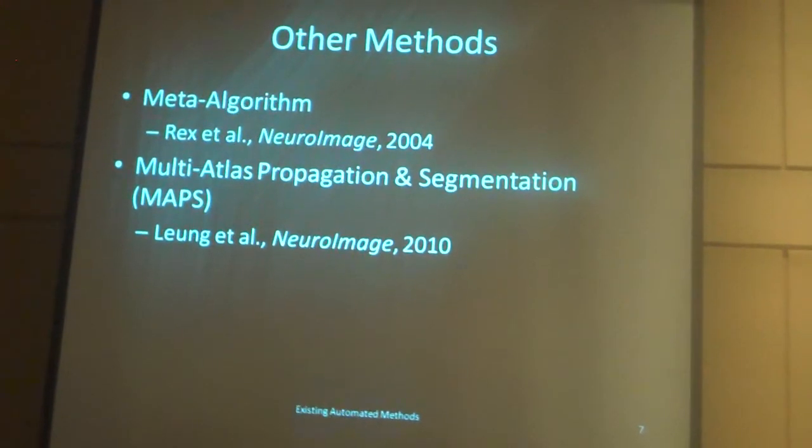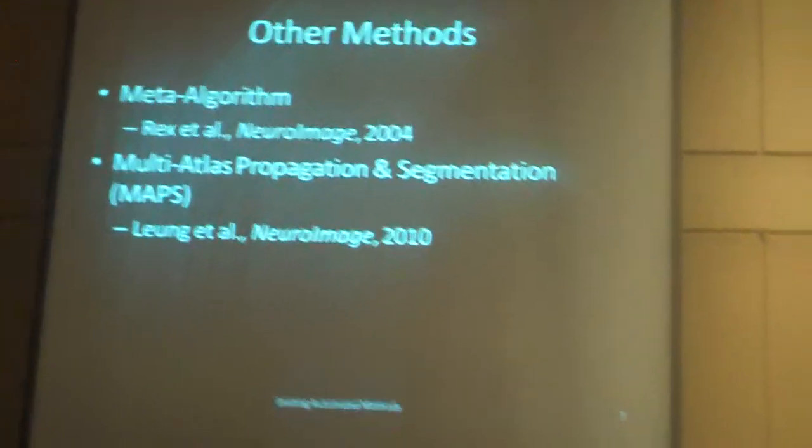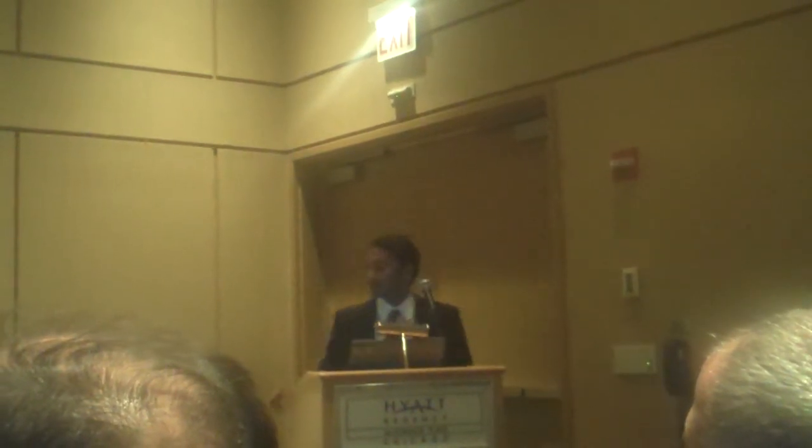Many of these algorithms are currently being used in neuroscience studies, but they require manual intervention and cleanup, which highlights the point that we need better skull stripping algorithms so that we can create more accurate segmentations and don't require any manual intervention.